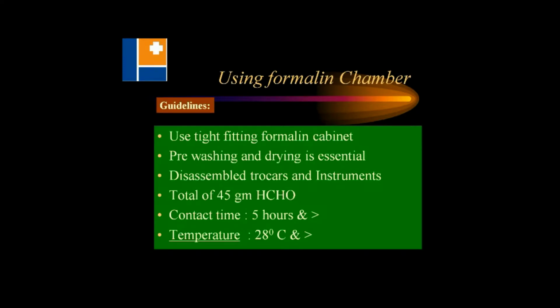And the chamber should be ideally kept outside the air conditioned theatre, because it needs a temperature of at least 25 to 28 degrees centigrade and higher. If it is in the air conditioned environment, then formalin vapor release is minimized, so it may not be very effective. But having said this, we don't recommend formalin chamber in the era of recent advances in the sterilization methodology, especially when we start operating on people with a hernia, and in these situations formalin chamber is usually not advised.